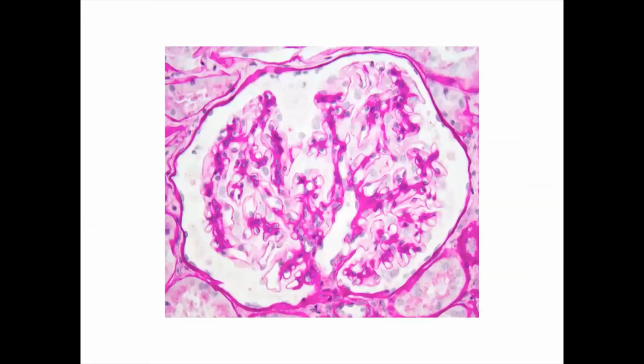And as we're used to, we start by washing our eyes and refreshing our memory about what a normal glomerulus looks like, with very thin glomerular basement membranes, normal cellularity, mesangium not expanded, normal mesangial cellularity with less than 3 or 4 mesangial cells per loop, and basically no hyalinosis in the hilar blood vessels.